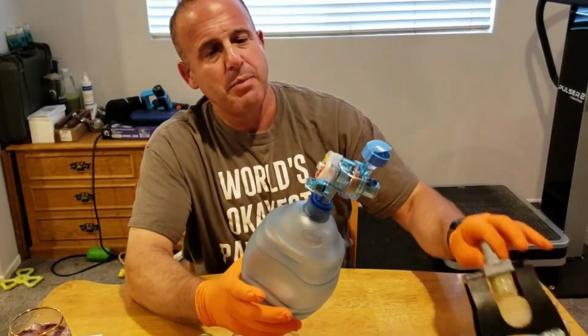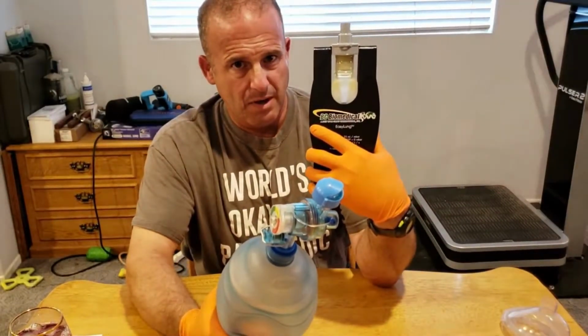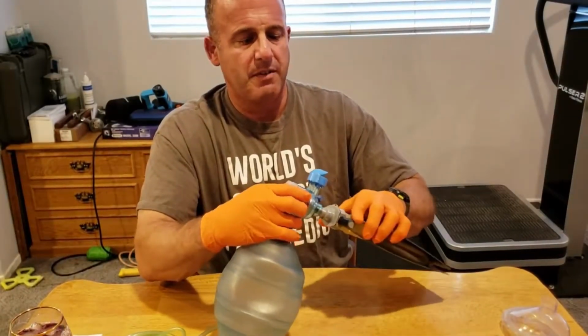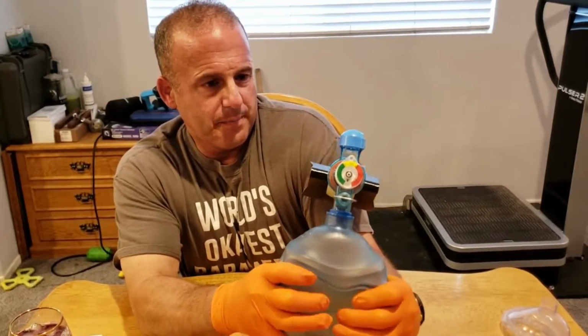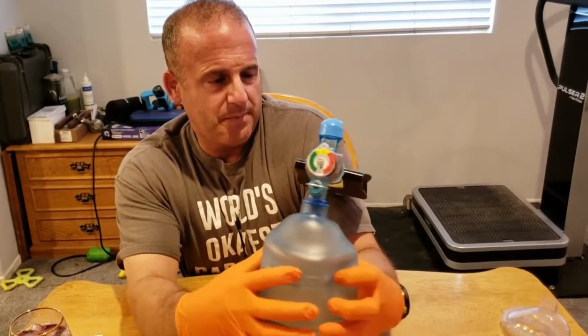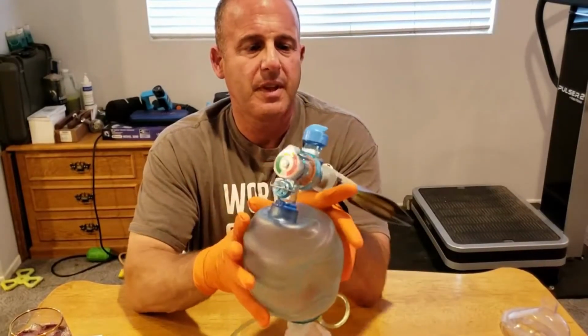To give you another example of how this works, we use an artificial lung with a capacity of 1,000 cc's of air. I squeeze two-handed. This is about 1,000 cc's of inflation. From the side, you can see it's fully inflated.